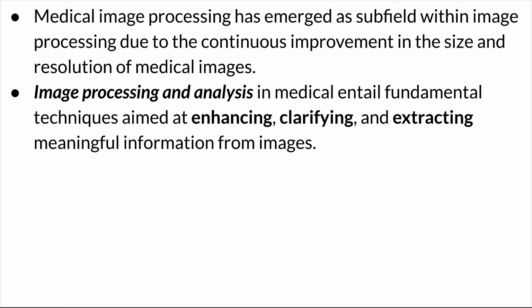So, what is image processing analysis in medical imaging? It entails the techniques or fundamentals that we use to enhance, clarify, and extract meaningful information from data. First, we are enhancing. Two, we want to make sure we classify whether this is indeed a tumor or not. But sometimes the radiologist is actually struggling: is it a tumor or not a tumor? So we need a better processing technique to clarify this and also to extract meaningful information.